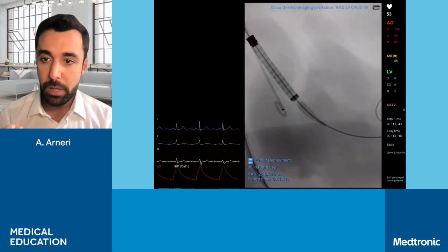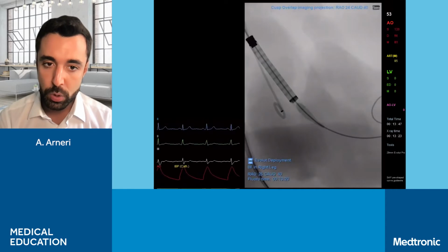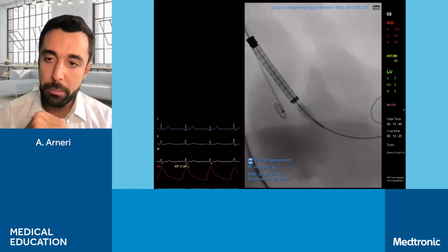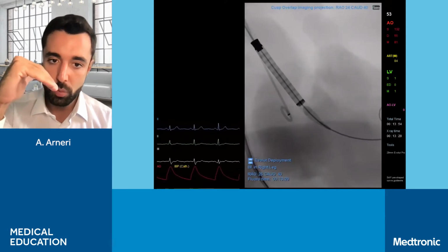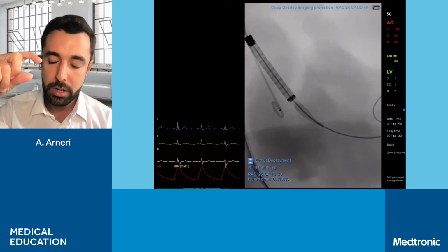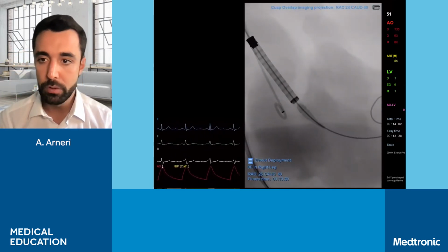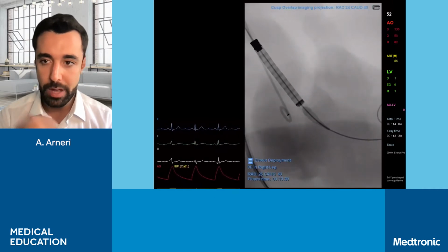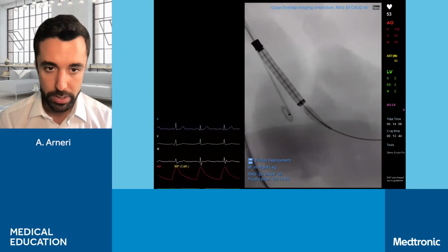Our goal is to have 3 millimeter implant depth, and to have 3 millimeter implant depth, we need to make sure that the bottom part of our pigtail is between node 0 and node 1, because the distance is 6 millimeter. So if we have that at half, we're at 3, and that's perfect implant depth to avoid conduction disturbances and to have the highest oversizing of our valve and reduce the PVL risk.